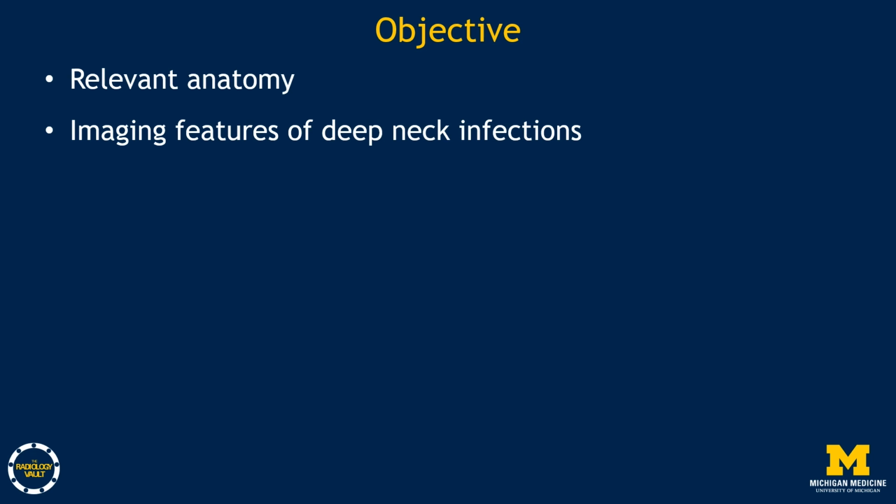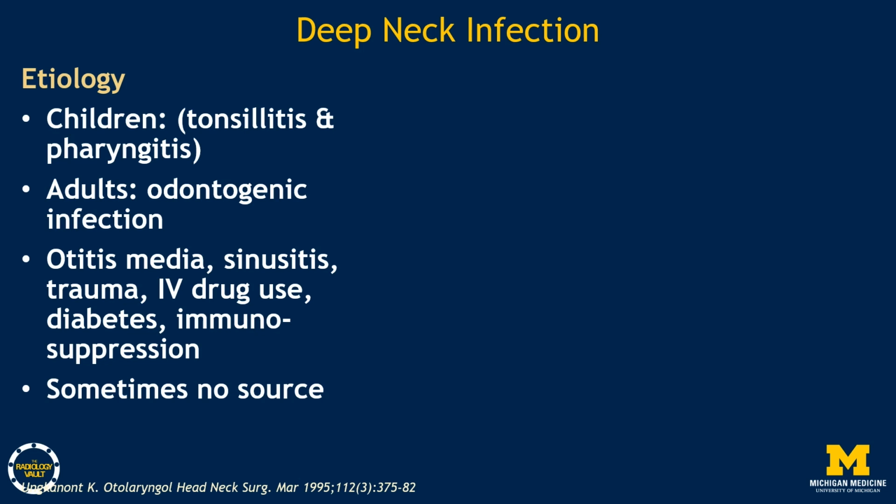The objective of this talk is to discuss the relevant anatomy and the spread pathways of infections in the neck, and then the imaging features of deep neck infections. Suppurative infections of the neck are uncommon but potentially serious with life-threatening complications.